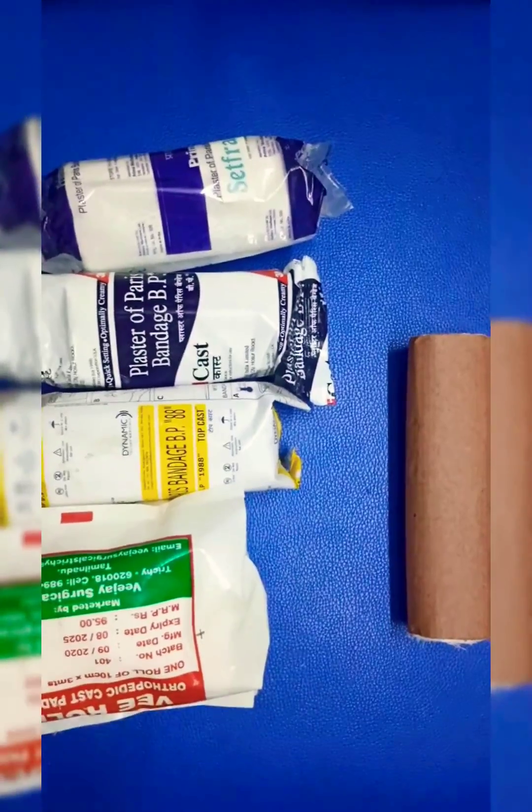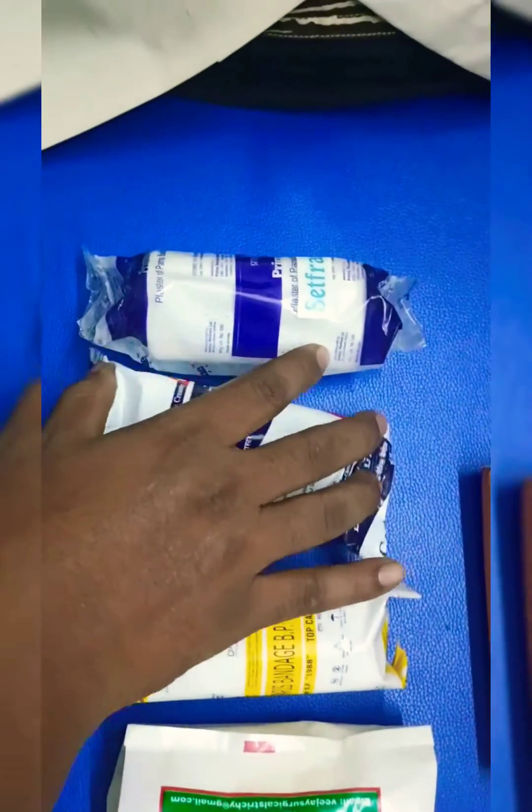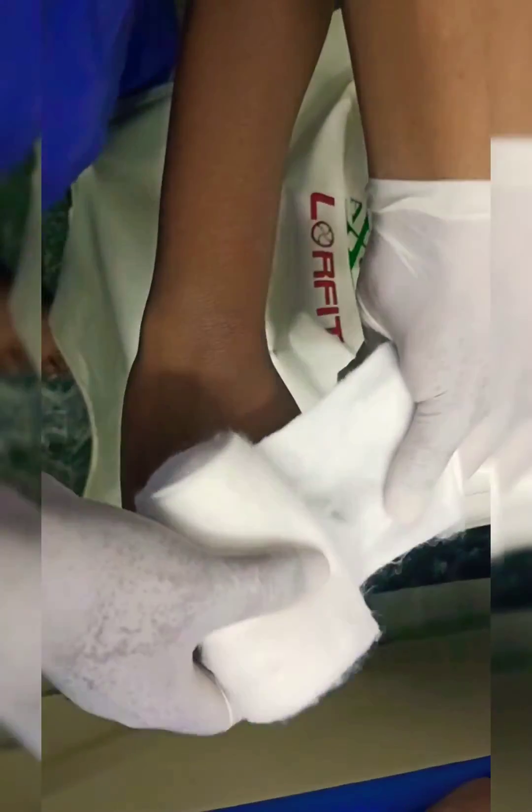Hi friends, today we are going to see how to apply a below elbow slab. Things needed for it: POP, soft roll, roller bandage, and water.